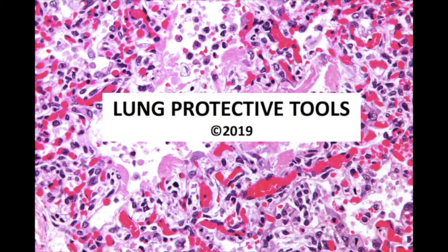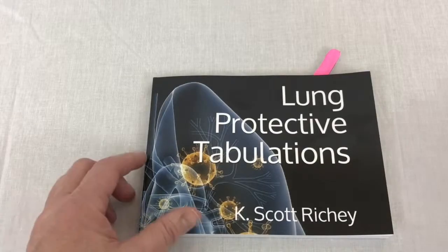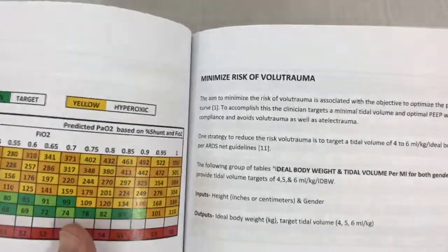Lung protective tools. Initial ventilator settings. Setting tidal volume and frequency. After obtaining my patient's height and the precise minute ventilation, I'm going to identify the best tidal volume frequency combination.